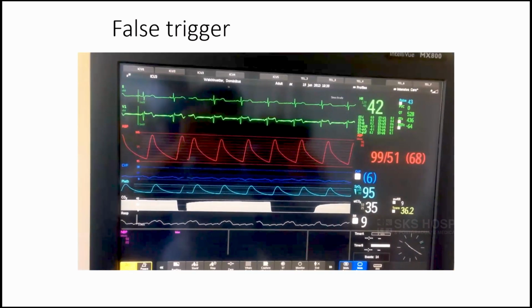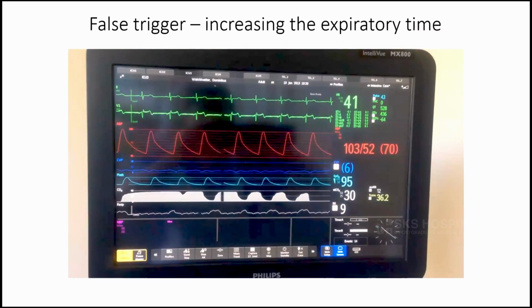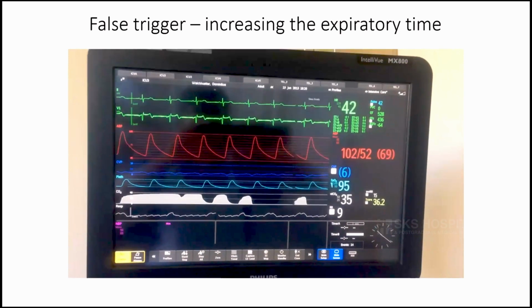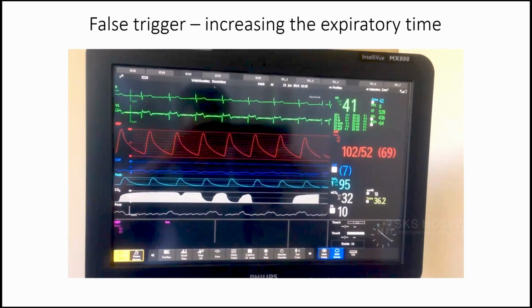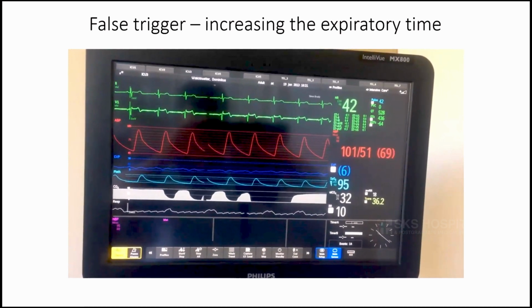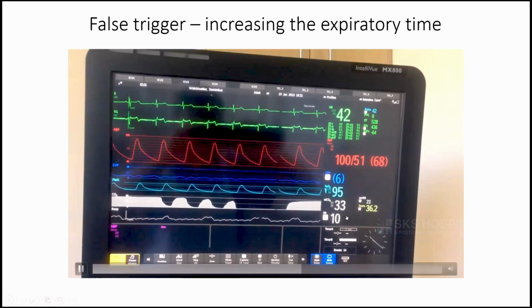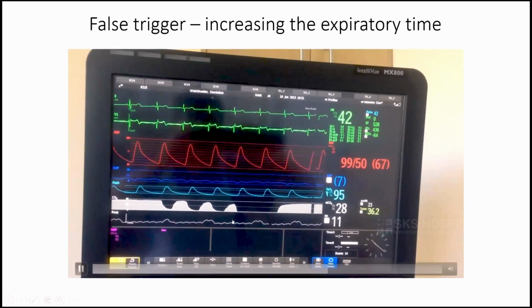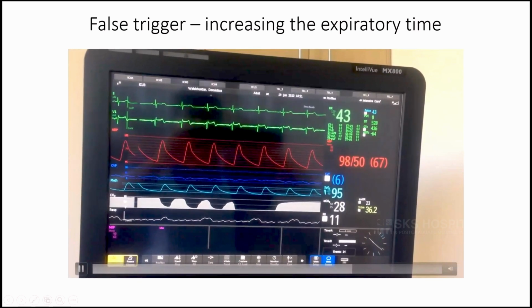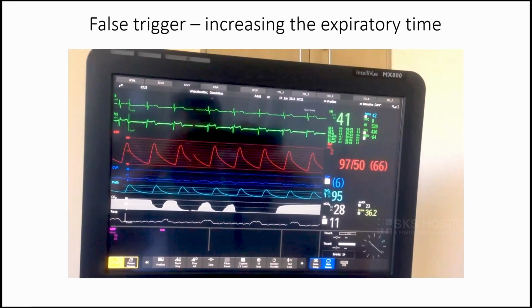Now in the next one, we have actually increased the expiratory time. When you increase the expiratory time like this, anesthetists will recognize this waveform. You have the cardiac oscillation, and the EtCO2 starts coming in small waves. If you look at the respiratory rate here, you see the rate is slowly increasing. So this cardiac oscillation is actually triggering the ventilator. So this again is a false trigger. Cardiac oscillations, secretions, and sometimes air leak can also trigger the ventilator.